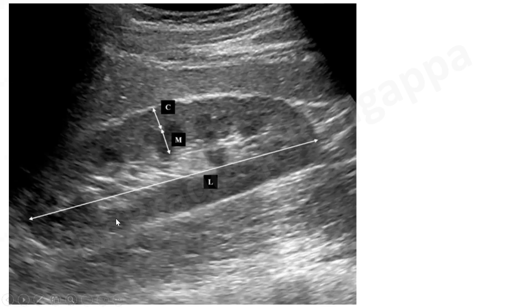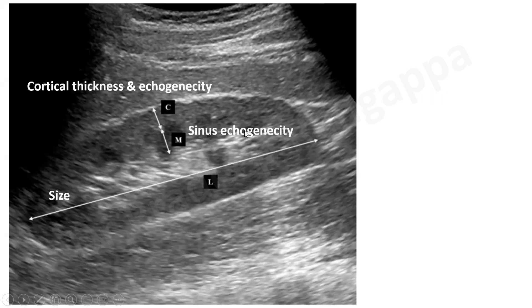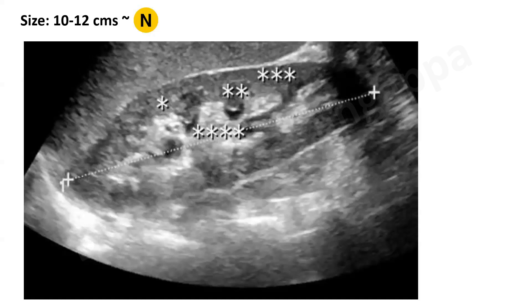When we are doing a renal ultrasound, this is how the kidney would look. We take the longitudinal measurement and look at the size of the kidney. This would be the renal sinus echogenicity, and this is the cortical thickness and echogenicity. These are the things we interpret in the renal ultrasound: size, sinus echogenicity, cortical thickness, cortical echogenicity, and perfusion. I'll take you through each of these as to how we look at them.